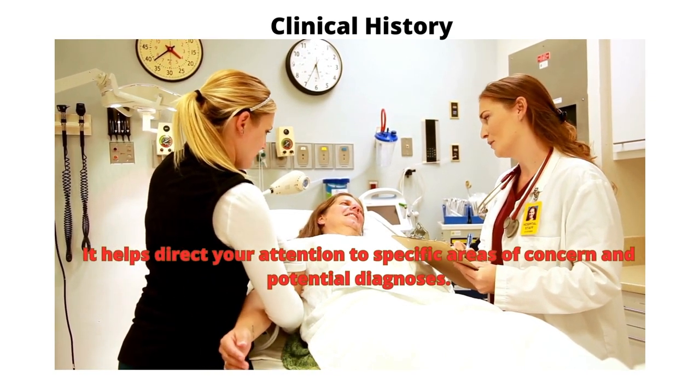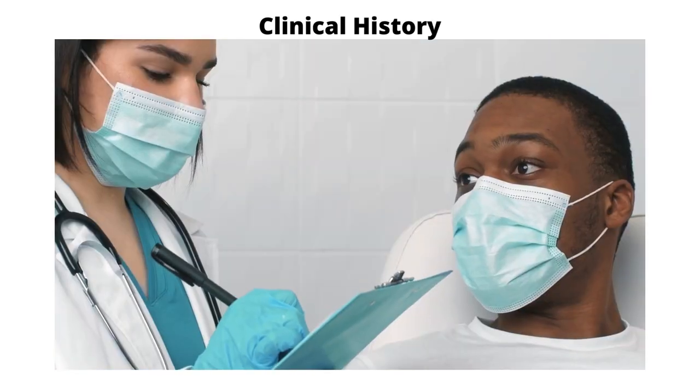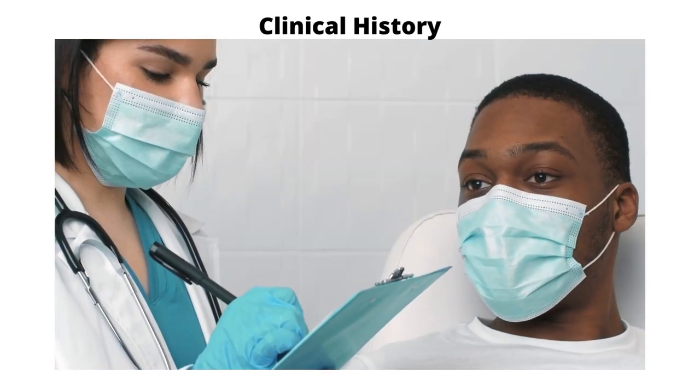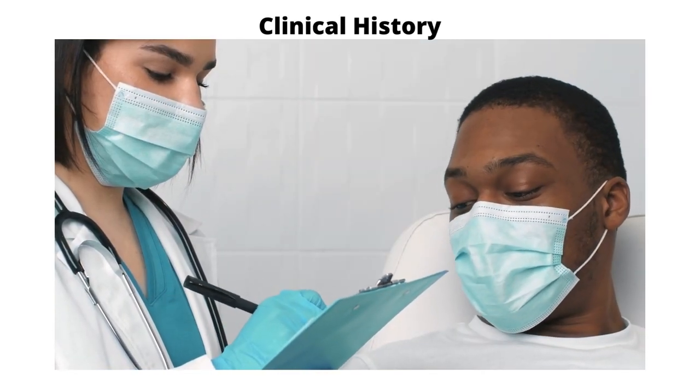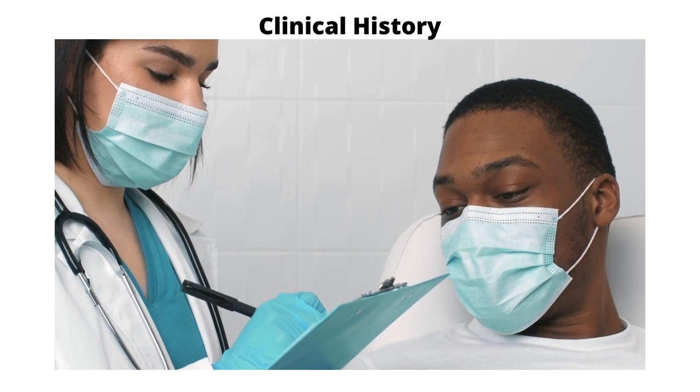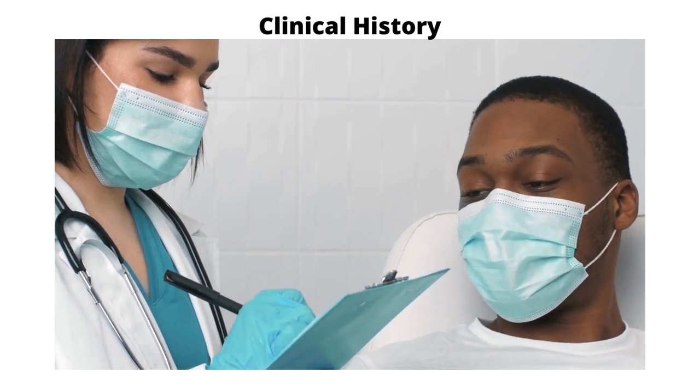For instance, knowing if the patient has a history of lung infections, cardiac issues, or trauma can influence the interpretation of the x-ray.